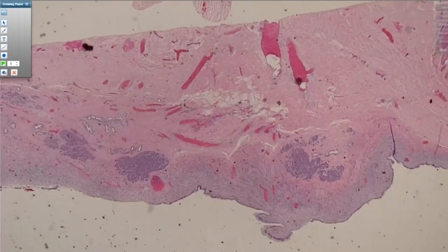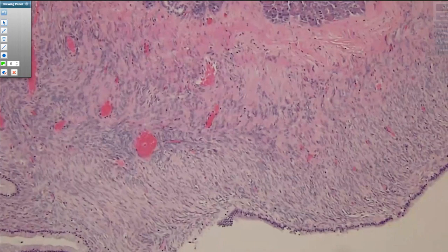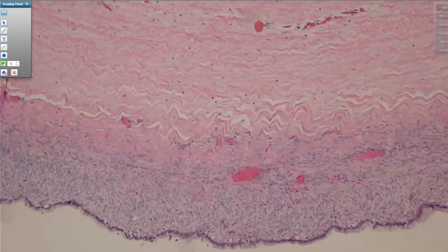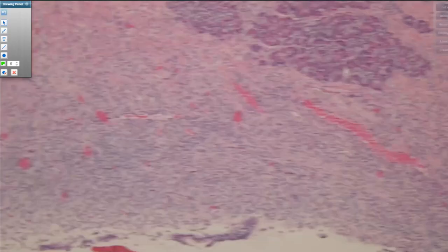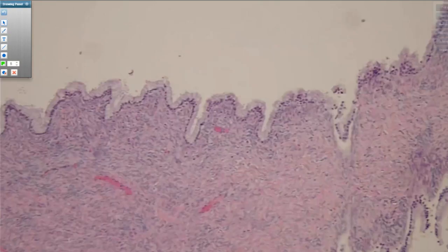The other thing you can take advantage of when you have all this degenerative change, and it can be tough sometimes to tell if it's cellular ovarian stroma or just really cellular fibrosis and reaction to this area of hemorrhage within the cyst wall, is the fact that ovarian stroma in an MCN, just like in the ovary, will stain for estrogen receptor and progesterone receptor. So in combination with putting the whole cyst through and hopefully finding a little focal mucinous epithelium, you can use an ER or PR to highlight the stroma. Not necessary for just general diagnostic purposes. It could be an H&E diagnosis, but if you ever are not sure if something's ovarian stroma, that can help.